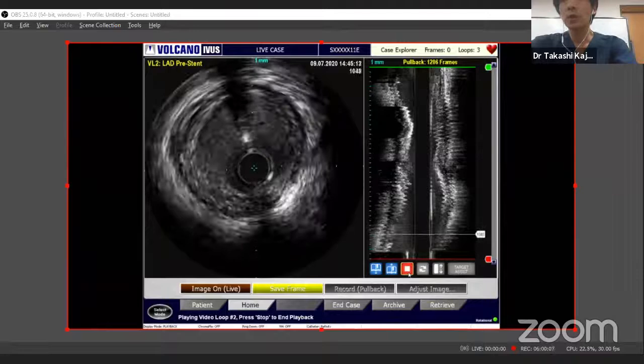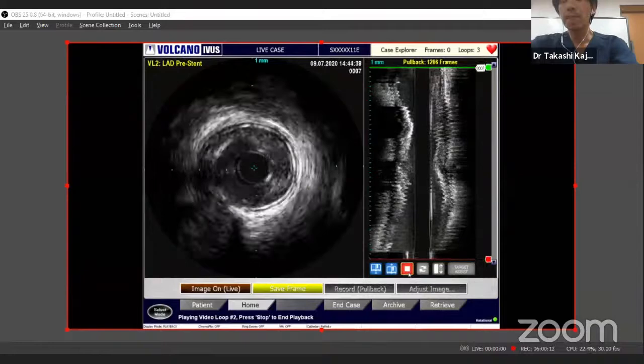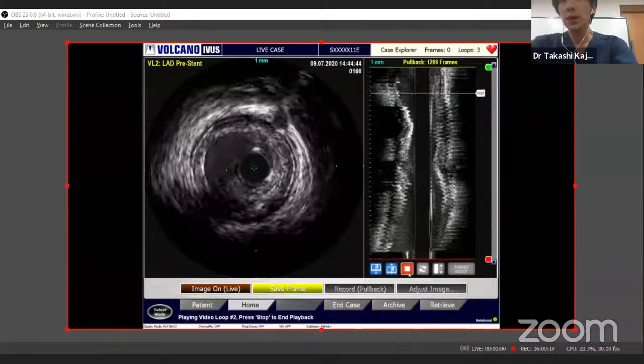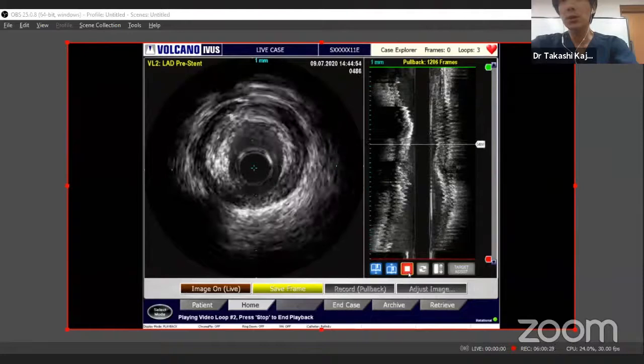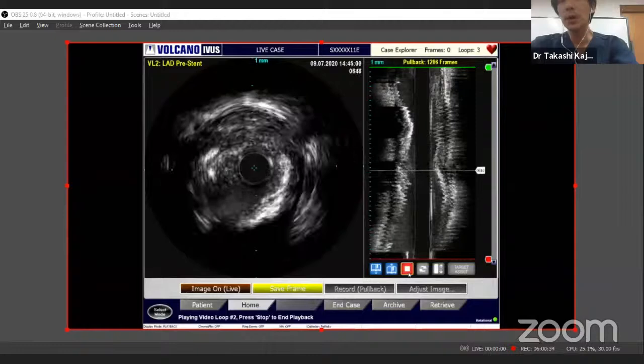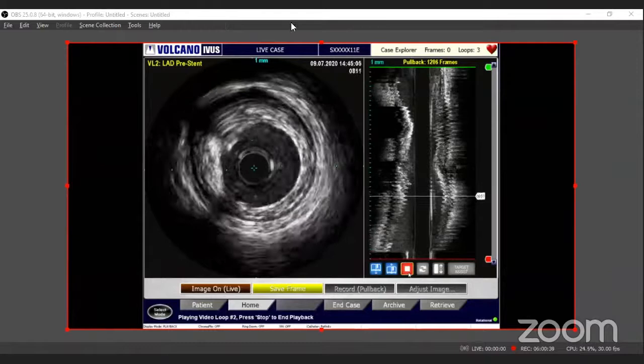And another point is, this case, first stent should be stent from left main to LAD or circumflex. This tight region, I mean this LAD ostium region, maybe it's better to stent from left main to LAD first, then second stent should go to circumflex.